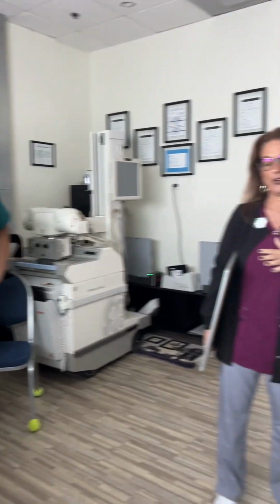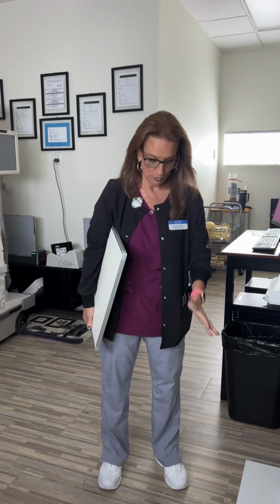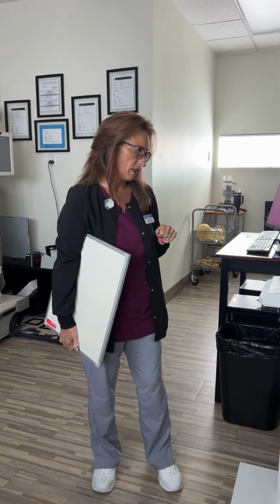Andrew is my patient. There is a separate video for changing instructions and history taking. So we're assuming that all of that's been done. His history has been taken. I've confirmed who he is, and he has changed. He literally would have nothing on from basically ankles up. His underwear could stay on as long as there were no snaps, buttons, metal, or zipper, and then his gown would be on open to the back.